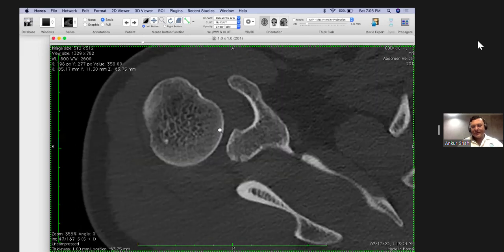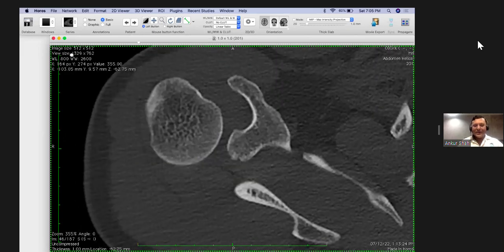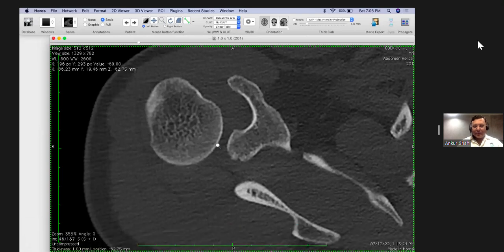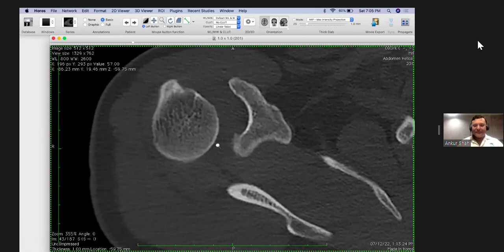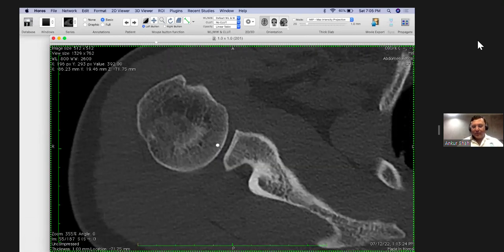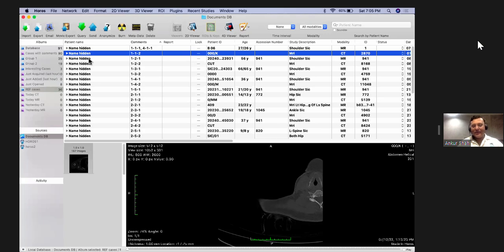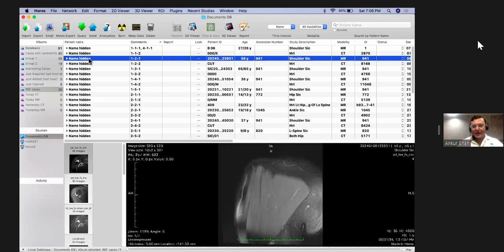If we don't search, we might completely miss it and pass that MRI as an insignificant MRI, or one not showing significant changes. But always be careful before you stamp any MRI as normal, particularly in young individuals, to have a closer look at the labrum, particularly the anteroinferior labrum or sometimes even the anterosuperior labrum, to find those subtle changes.